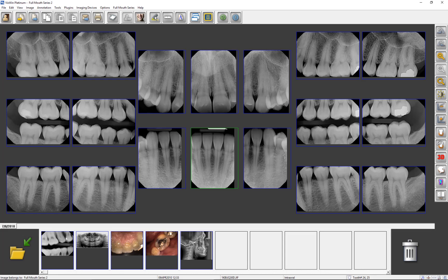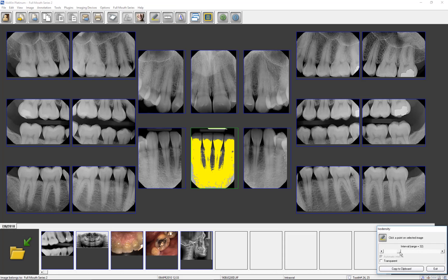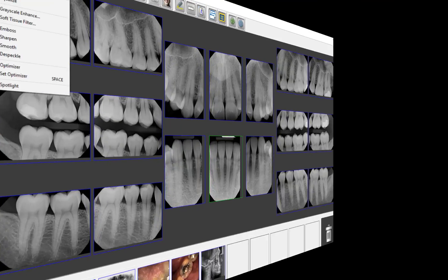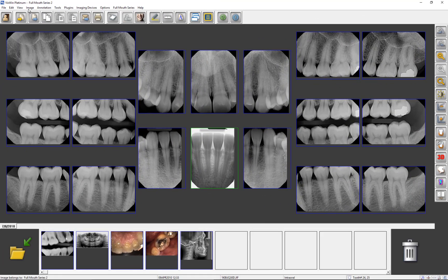Most of these tools have already been discussed, but there are some new additions or ones with similar functions and new names. The toolbar ISO density feature will replace a range of gray shades in the selected image with a color, which may be used to better visualize areas of uniform radiographic density. New tools in the Image tab are Rotate 180 degrees, Flip (which allows you to flip the image from a CCD sensor), Mirror (flipping the image across the vertical axis), and Reverse (which converts negative into positive). This completes the overview of VixWin's image enhancement tools.